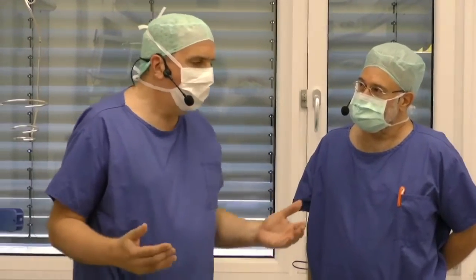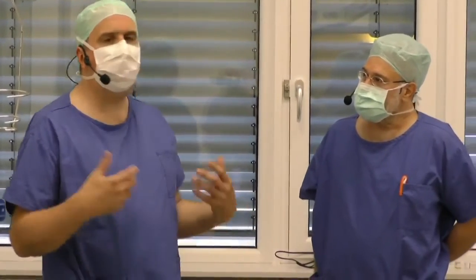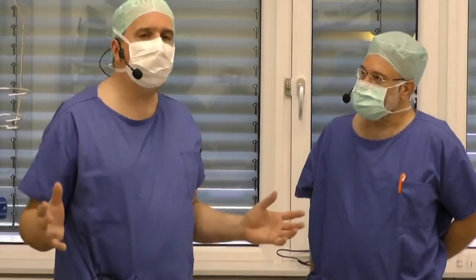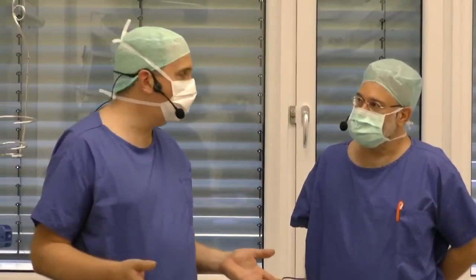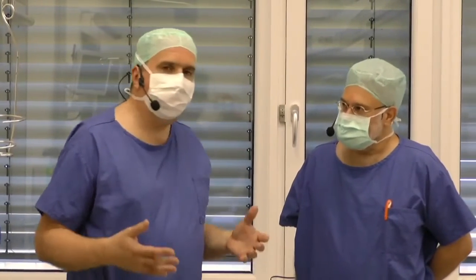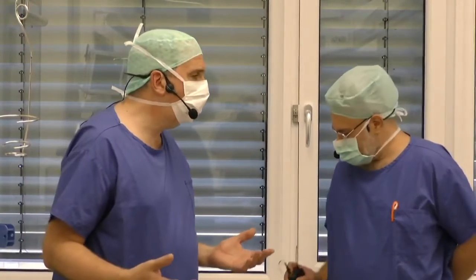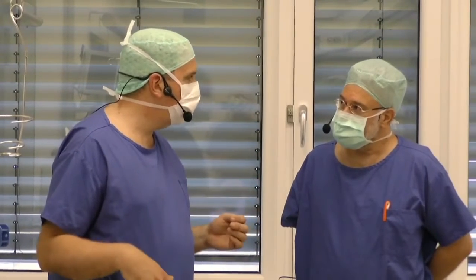For example, if you have patients unsatisfied with the visual acuity, or patients who say, okay, you told me the side effects of the multifocality, but I cannot deal with it. It's very easy to explant this lens. We don't want to explant the lens, but it's very easy to do so, where we all know it's much more difficult to explant an endocapsular implanted lens after, let's say, half a year or so.